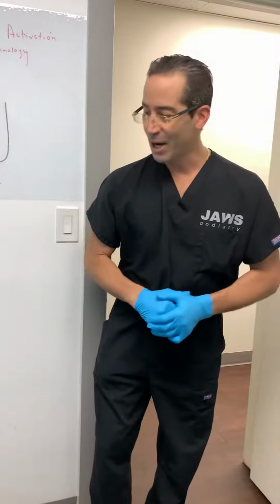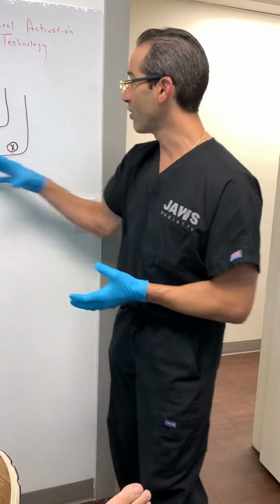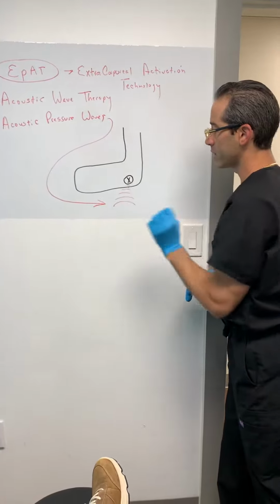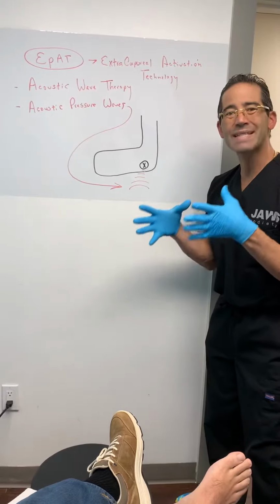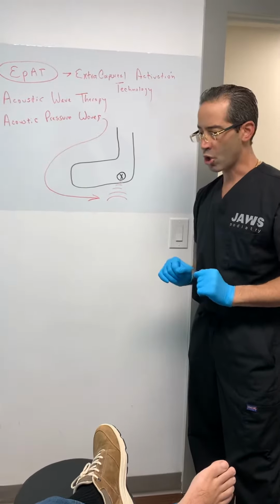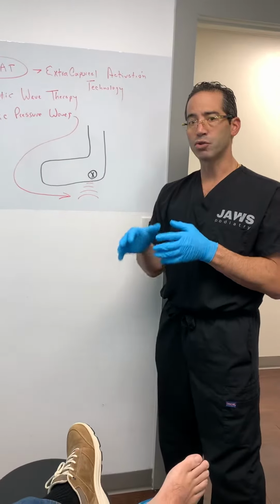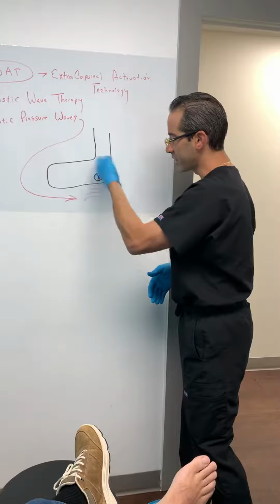Thumbs up, exactly. We'll perform the procedure, and then I'm definitely going to take a little more time to explain exactly how it works and what it does. Very briefly, it's acoustic pressure waves that are transmitted into, in this case, the heel, the point of maximal tenderness, and it is a regenerative type of procedure. We focus our efforts a lot on regeneration. I've moved away more from the world of cortisone and synthetics. We're not going to get too complex on the physiological and cellular standpoint of what it does, but it basically helps regenerate the area.